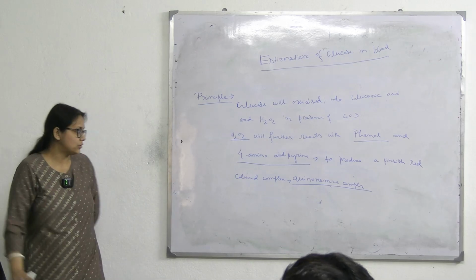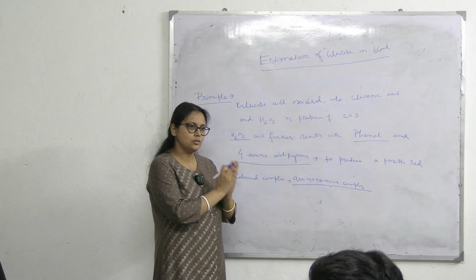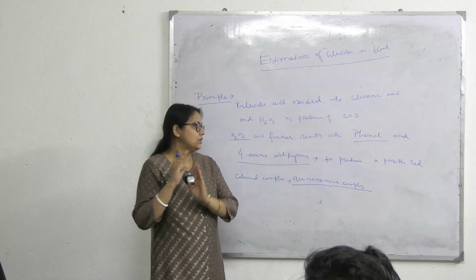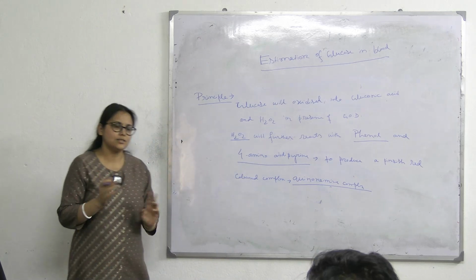হ্যাঁ, সেটা বটে। আমি বলতে চাইছি যে, concentration of glucose in a given sample or color intensity of color that is produced, that is red color. Is there any relation?